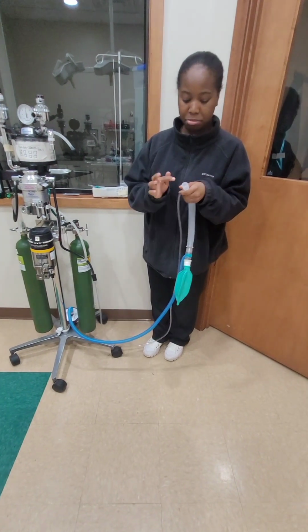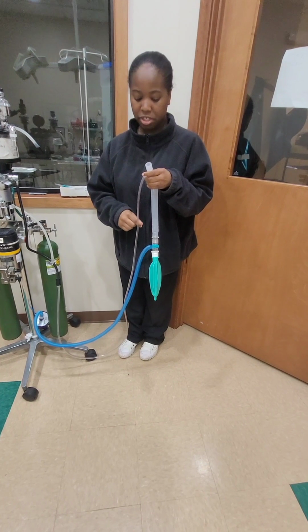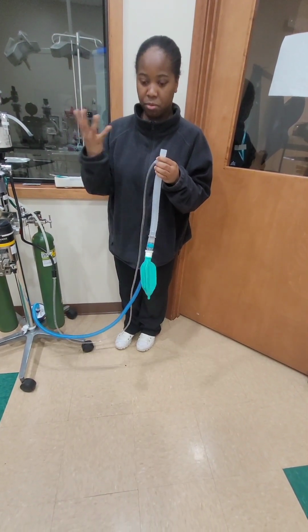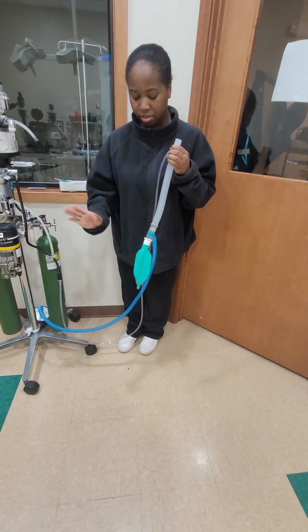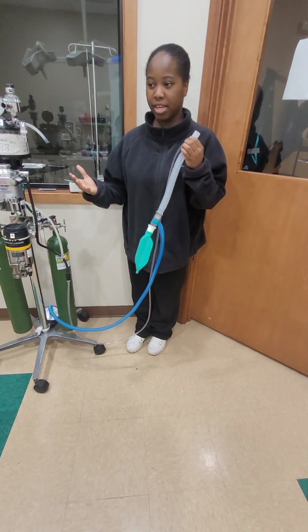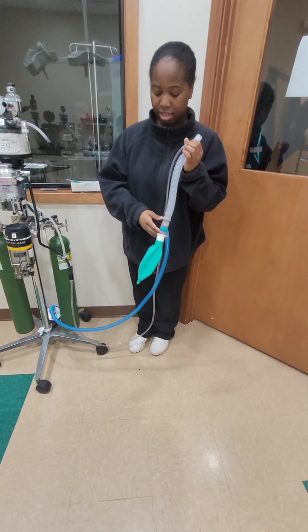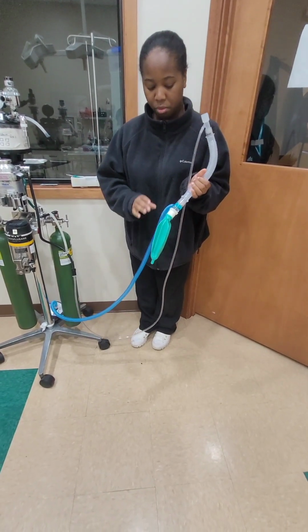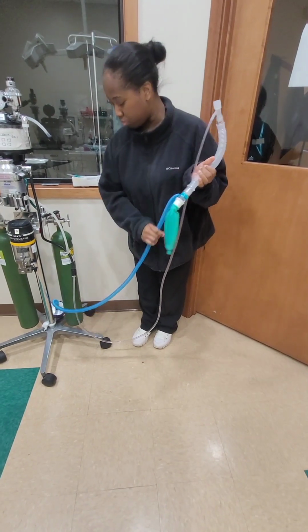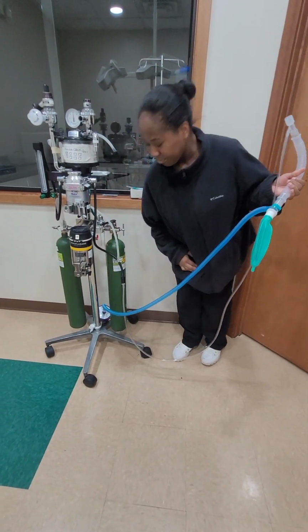The patient is breathing in the O2 inhalant mixture from here, and what they exhale comes in through here. The reservoir bag holds onto any residual inhalant O2 mixture, and any residual will come in through this blue scavenge tubing out through the air canister right at the bottom.